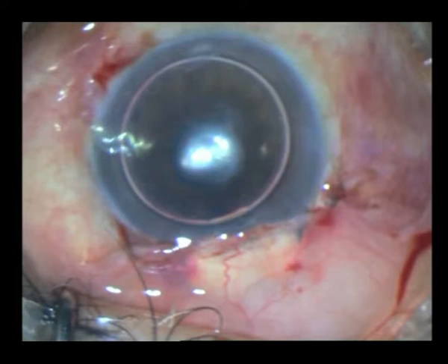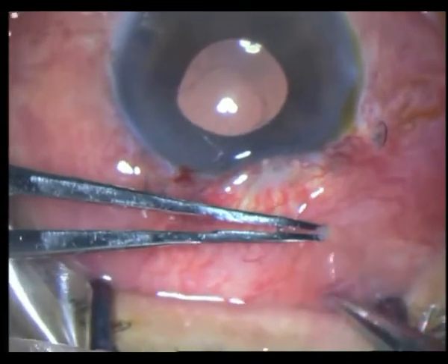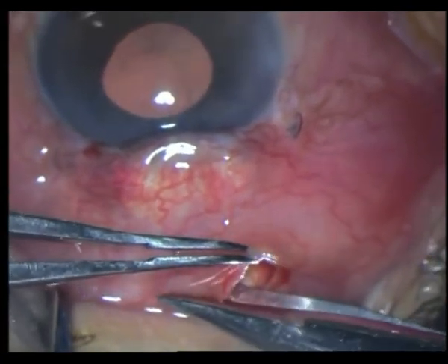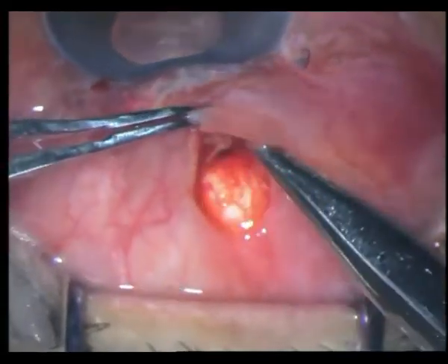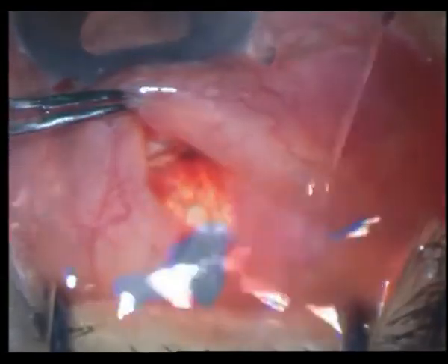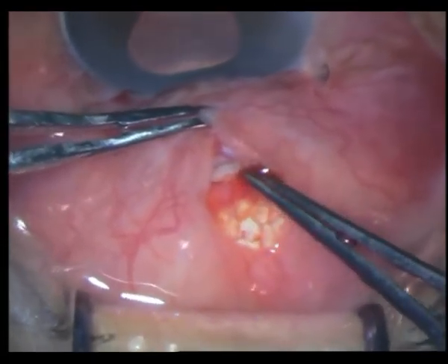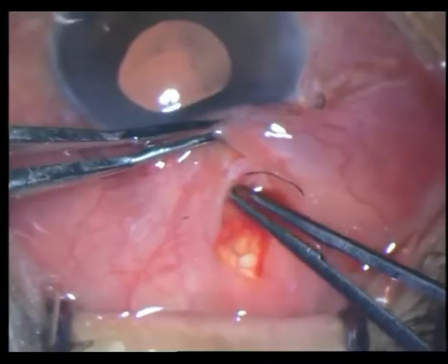I had to go in again after two weeks. You can see me going near the fornix, just opening up a little, and if you remember the mattress suture I had placed behind — I cut and pulled out that suture. I probably should not have put the suture in the first place, but it was important since the pressure was zero at that time. This defect I closed with a cross-stitch using an absorbable Vicryl suture.